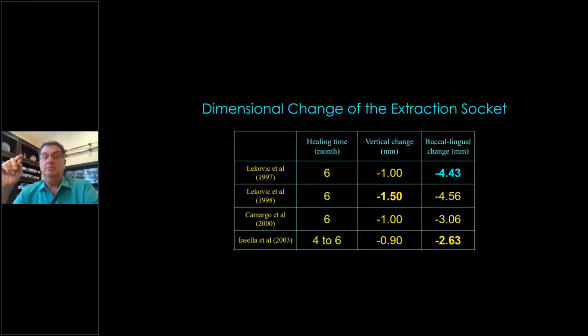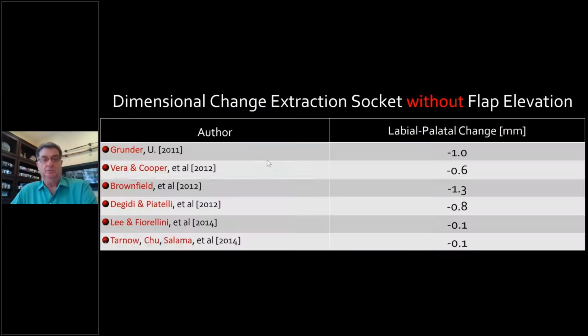So here it is. How many people know how much bone loss, buccolingually dimensional change, can we expect? This is dimension of the ridge. What happens if you don't open a flap? So this was all with opening a flap. And it wasn't until relatively recently, Uli Grunder, who you mentioned, in 2011 was the first person I know that actually measured the buccolingual dimension after an extraction and placing an implant on the palate, away with the gap, away from the buccal plate, and just watching it for 6 months. Only 1 millimeter. That's completely different than 4 millimeters, 3 millimeters. This is now something you might be able to accept. The key was not opening a flap.